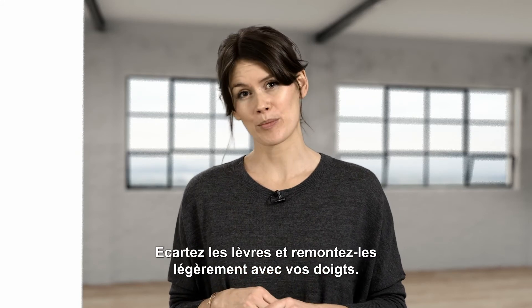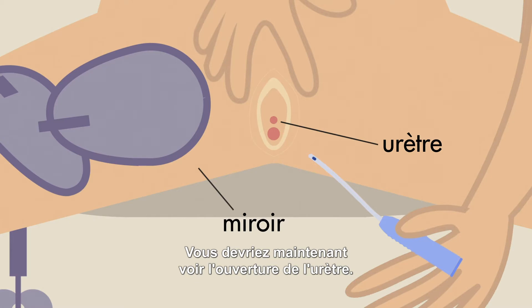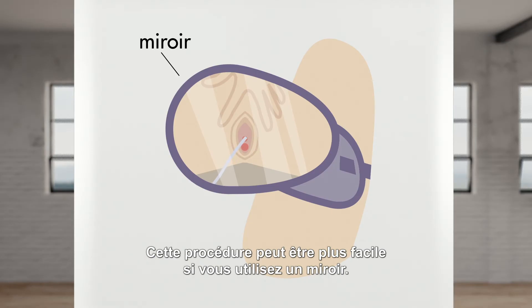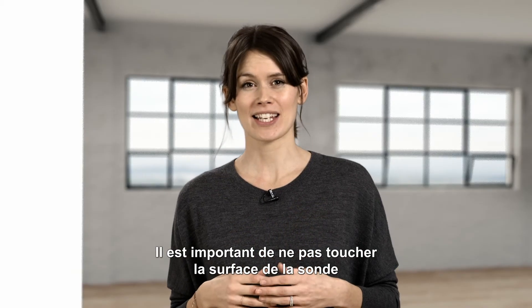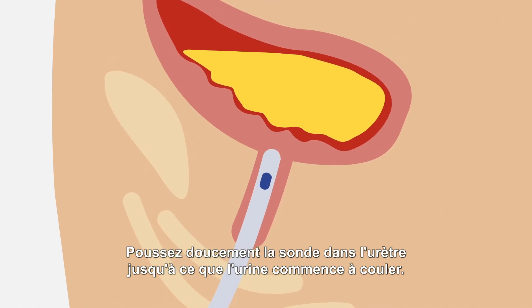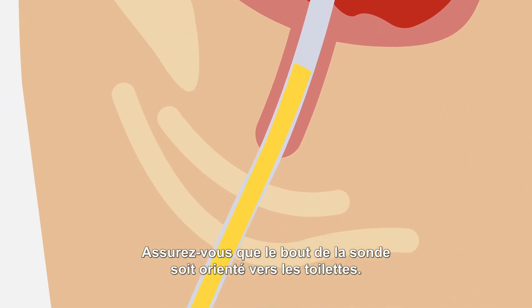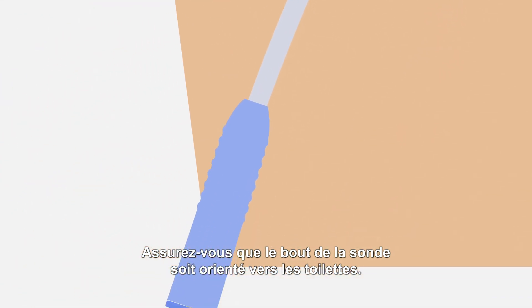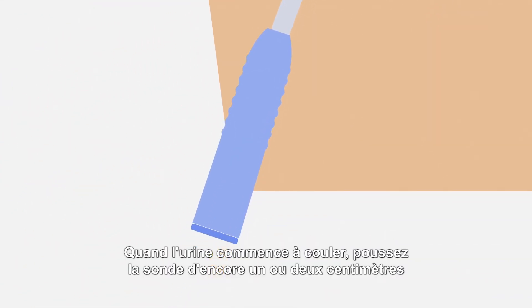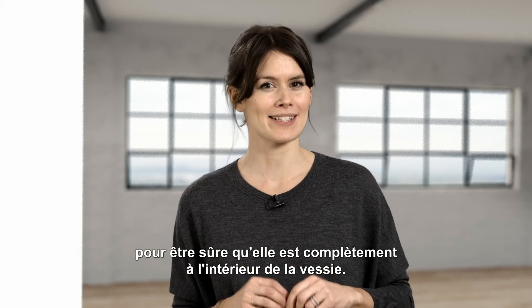Spread the opening and lift it gently upwards with your fingers. You should now be able to see the opening of the urethra. This procedure can be easier if you use a mirror. It is important not to touch the catheter surface to avoid bacteria going into the body. Slowly push the catheter into the urethra until the urine starts to flow. Make sure the funnel end is pointing into the toilet. When the urine starts to flow, push the catheter one or two centimeters more to make sure it is completely inside the bladder.